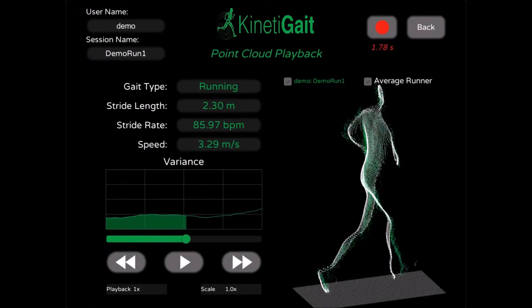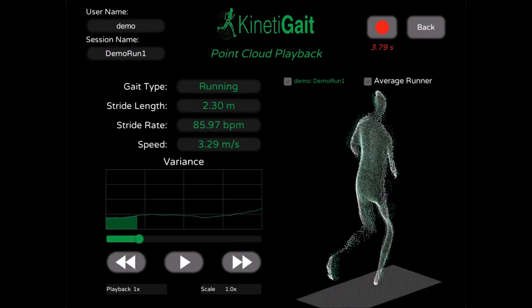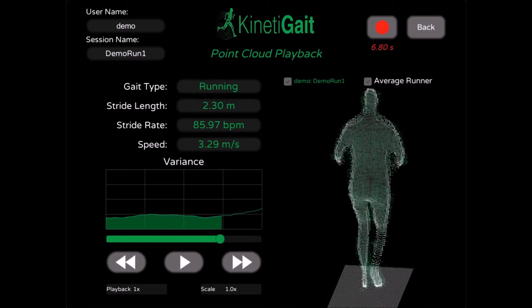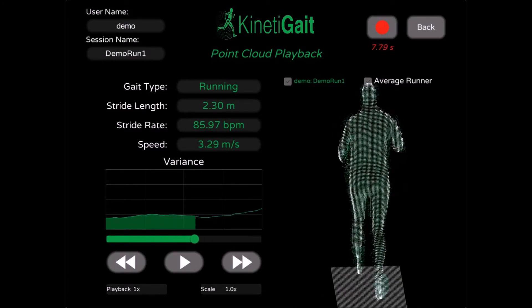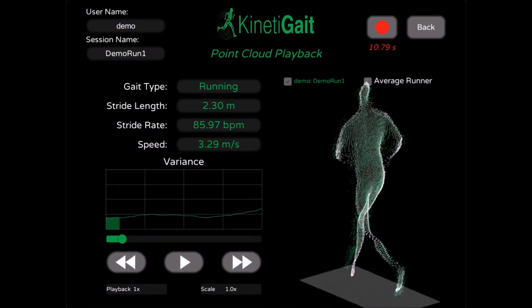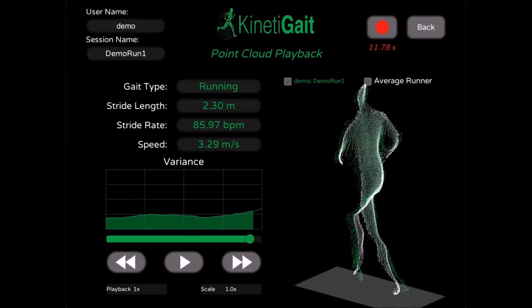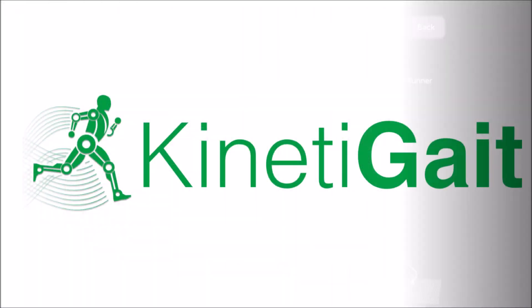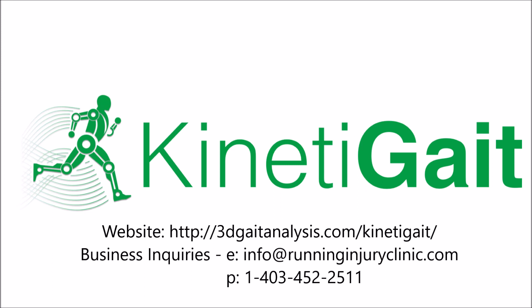Because KinetiGate utilizes markerless motion capture, the output generated represents a three-dimensional view of their global movement pattern, as opposed to discrete joint angles. This greatly reduces the time needed to collect data. For more information, consult our user manual or visit our website.